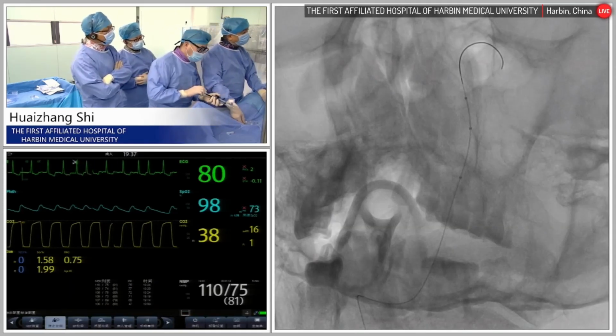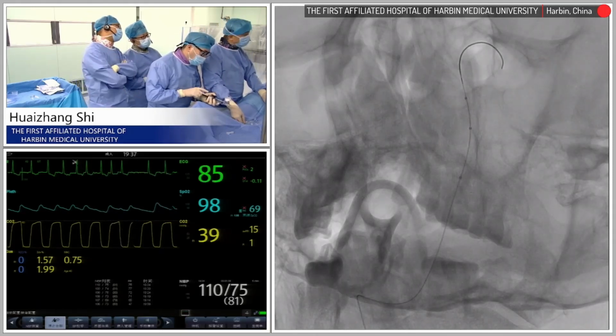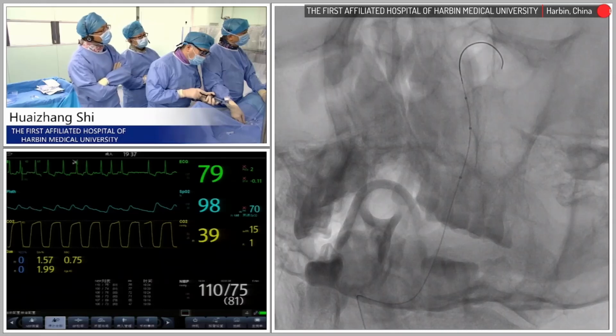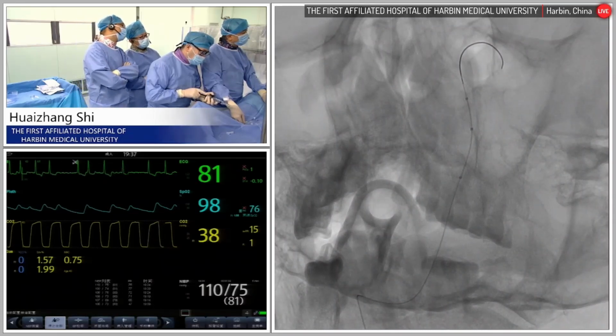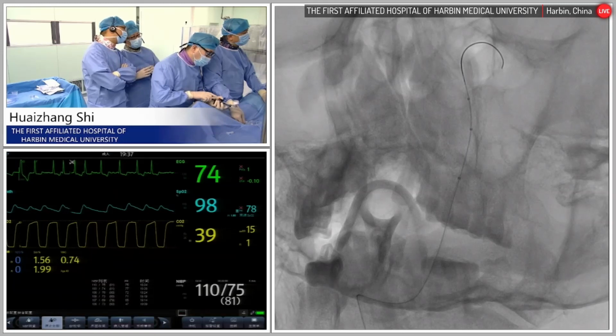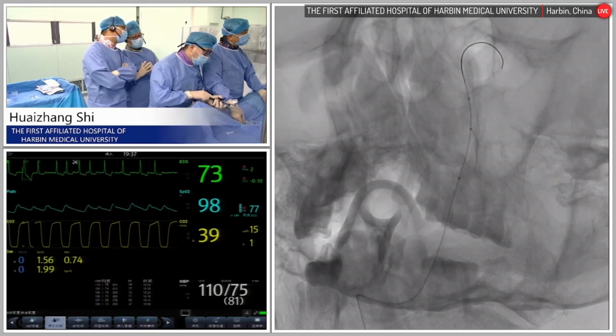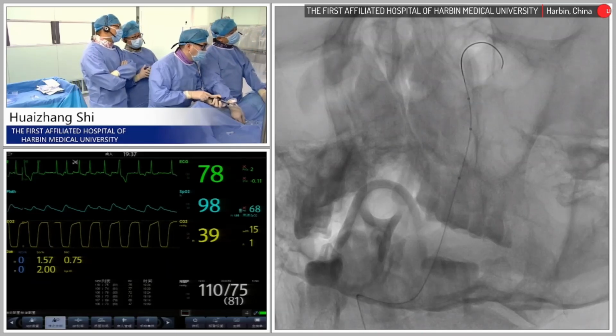Okay. One. The normal pressure is 6. Two. Three. So when we use this Fastunnel device, does this spasm happen very often? Or sometimes it doesn't happen very often. Just sometimes. Four.